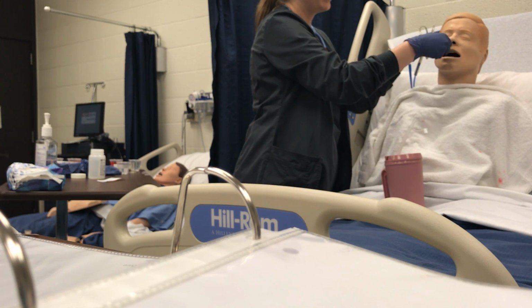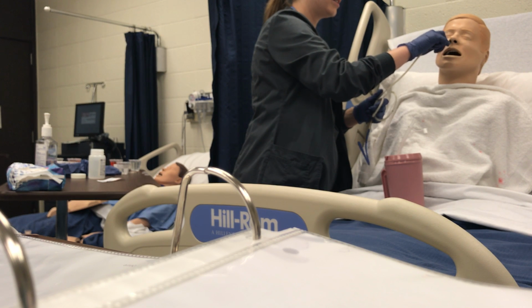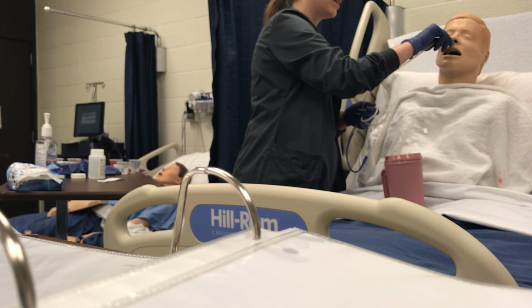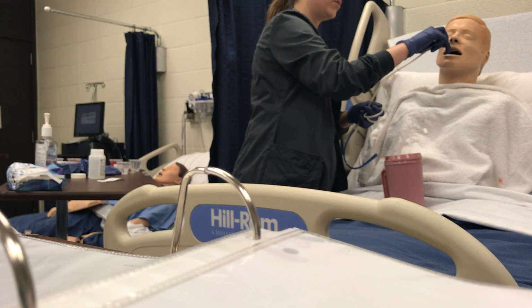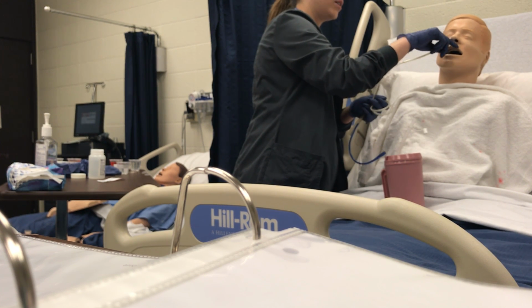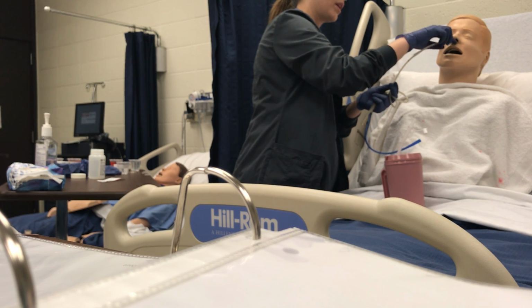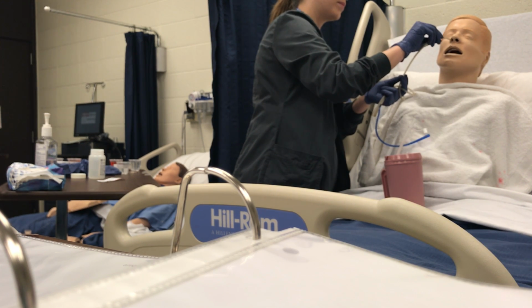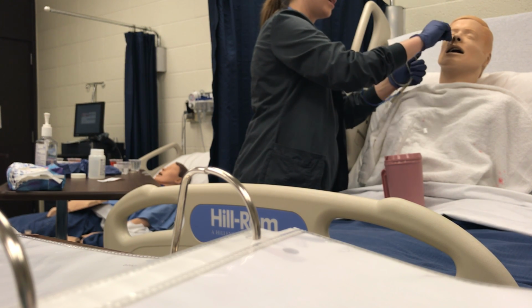I'm going to curve it 180 degrees, and I'm going to have him take a sip of water, advance it 2 to 4 inches, sip of water, advance another 2 to 4 inches, another sip of water, advance 2 to 4 inches, and I would continue to do that until I had the placement that I wanted. And we're almost there. All right, so we got it.